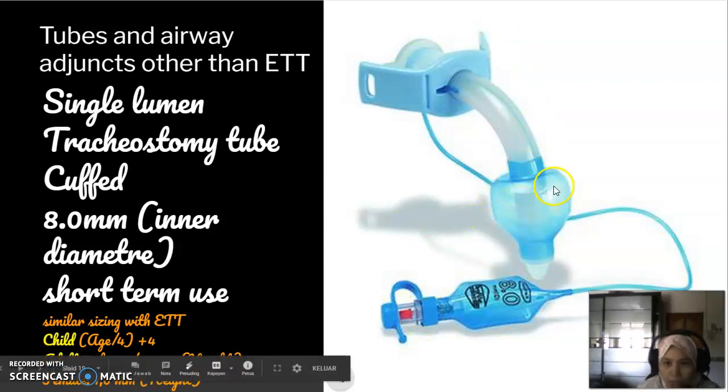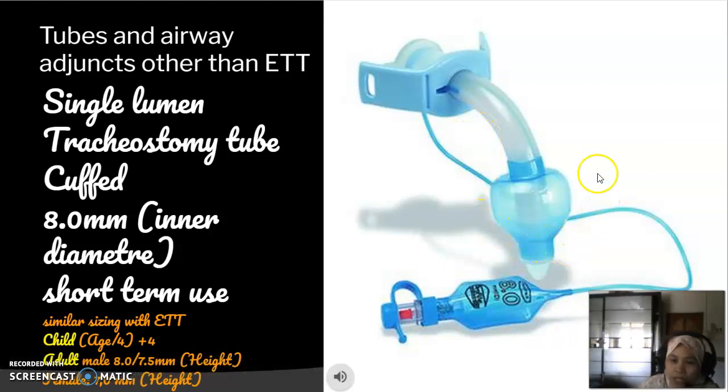Here I will talk about tracheostomy tube. Basically, tracheostomy tube is similar to the endotracheal tube, except that it is inserted at the anterior wall of the trachea. The tracheostomy tube has two limbs: one is a horizontal limb and the other is a vertical limb that sits within the trachea itself. In this picture you can see a single lumen cuffed tracheostomy tube.